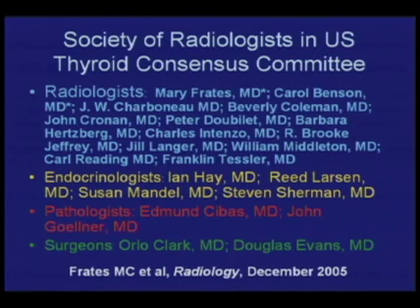Now, one of the problems that we as ultrasound physicians come across very commonly is the incidental detection of a thyroid nodule. In other words, a non-palpable nodule that comes to attention because the patient is having imaging, ultrasound, or perhaps CT or MRI of the neck. It's been a clinical dilemma what to do with these nodules, whereas we know they are very, very common. We also know that only a small fraction of them will ultimately be a clinically relevant cancer.